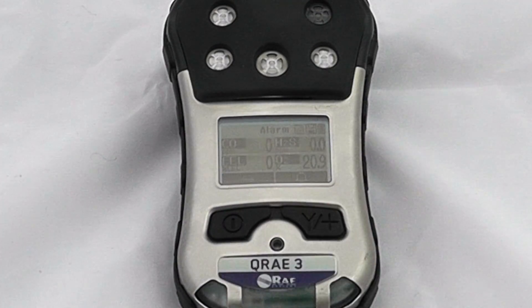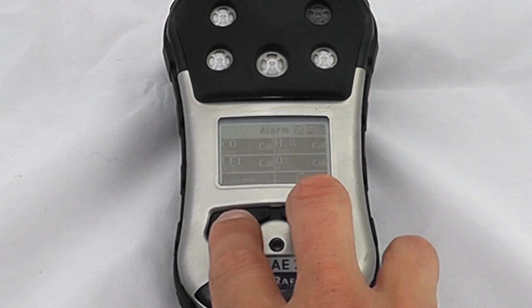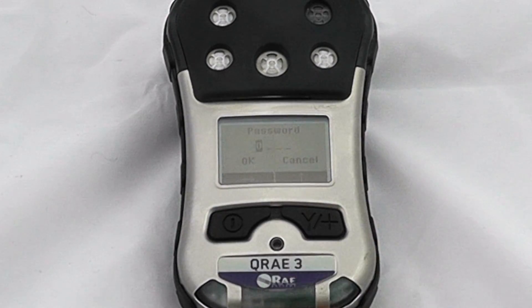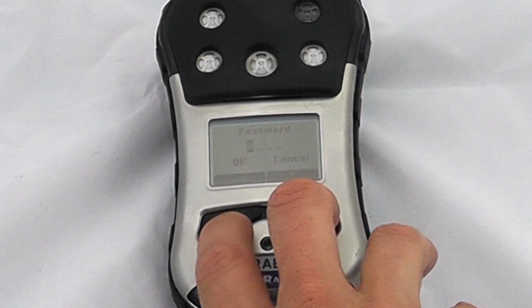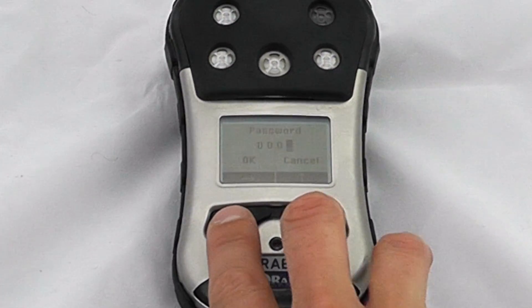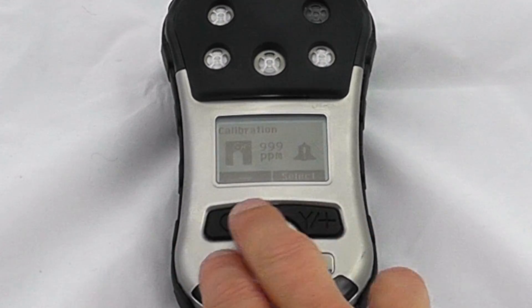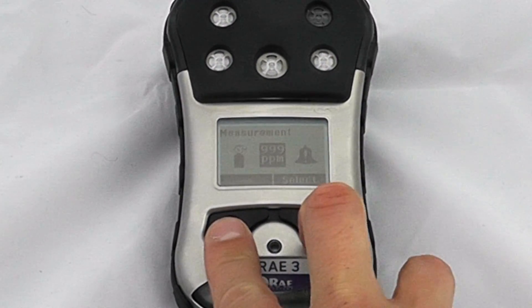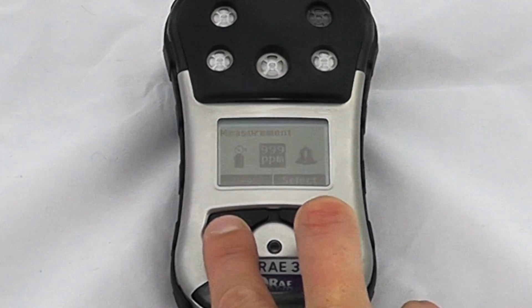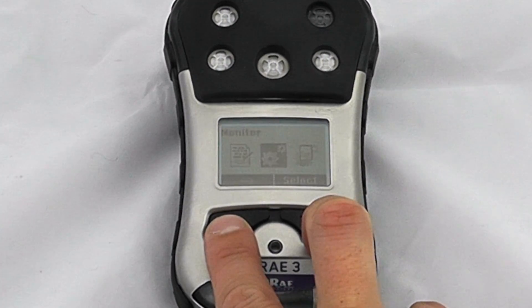At the moment it's letting me know all sensors need a calibration, so we'll calibrate these with a standard full gas mix. To get into the menus, hold the mode and yes buttons together. It will ask for a password — as standard this is 0000 — and now we're in the back menu with calibration options. This is very similar to any other Ray instruments.